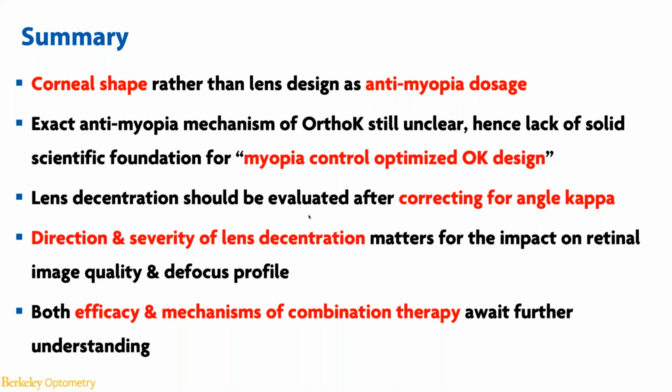This is especially important for ortho-K studies, because what is actually changed on the cornea is the anti-myopia dosage rather than the optics of the lens.